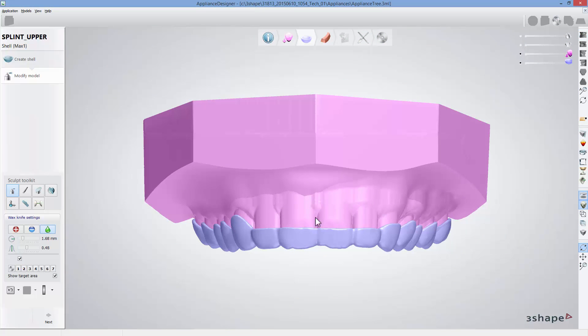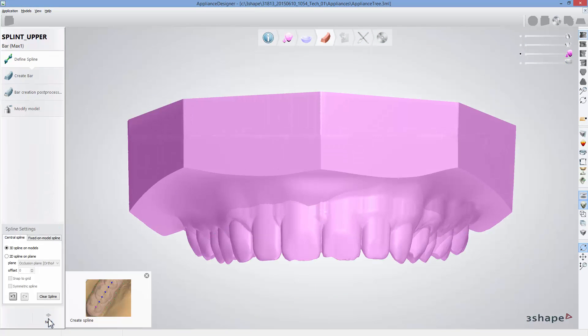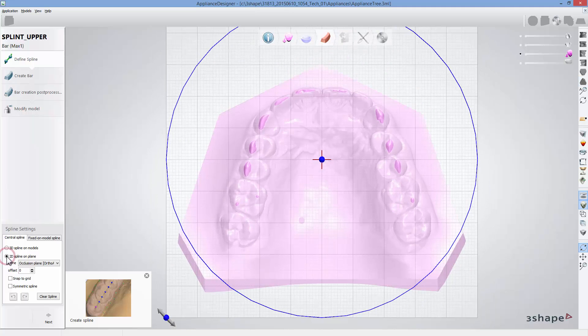The following step should be the bar creation. Start bar design with drawing a spline. You can draw it directly on the model based on default settings or on previously set occlusal plane using spline on plane to keep the initially defined angulation.